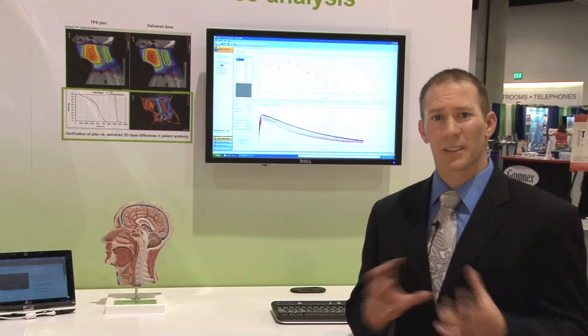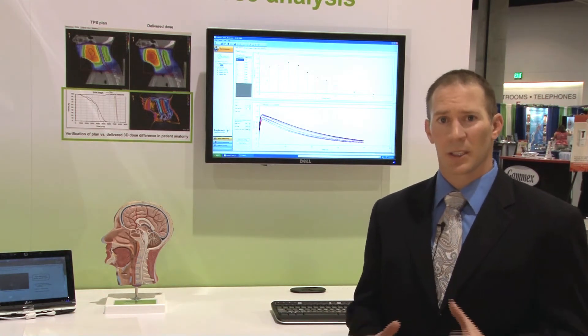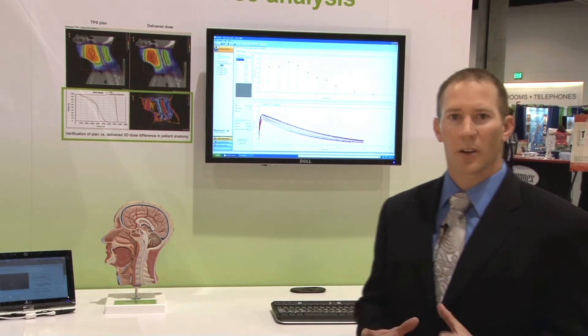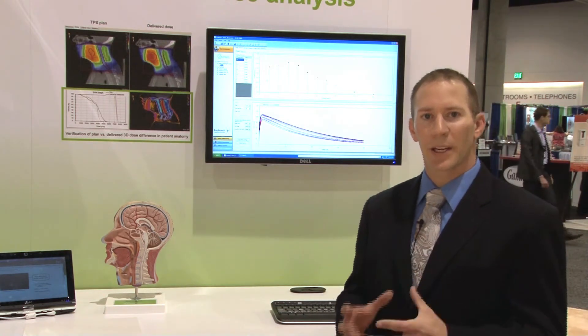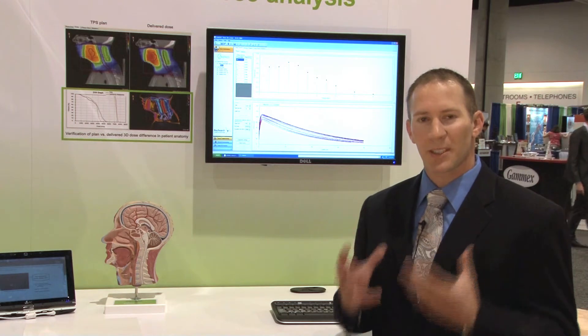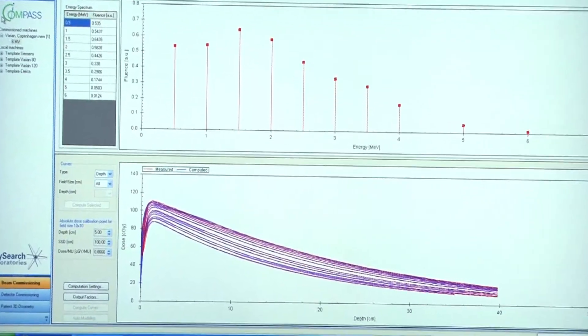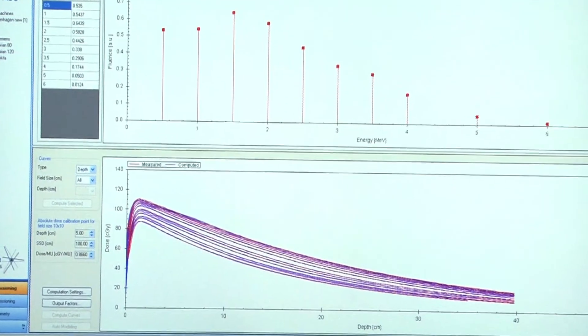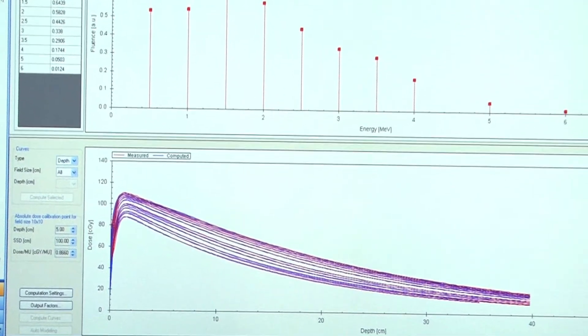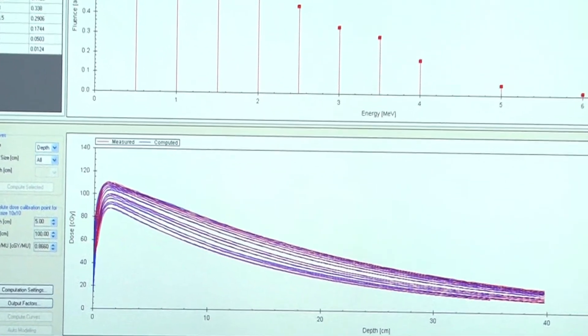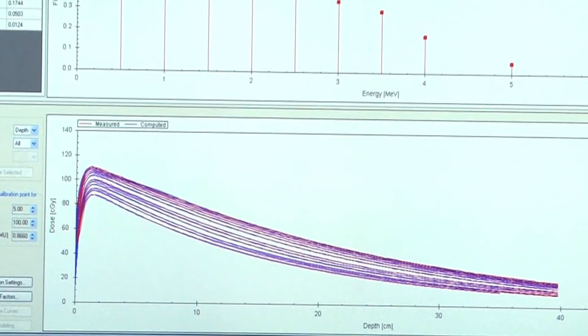The first component is the software. With the software we actually create a beam model specific to your machine. We take existing scan data and we create a model from that, which is represented here.